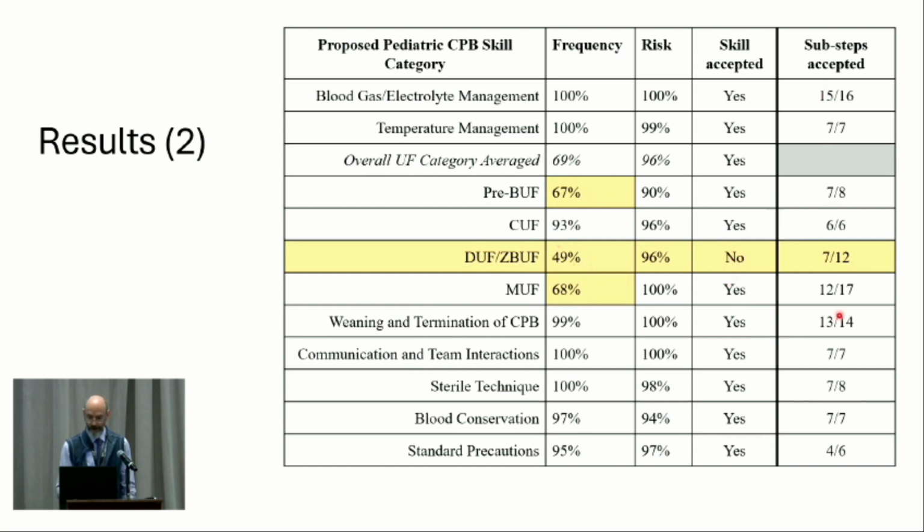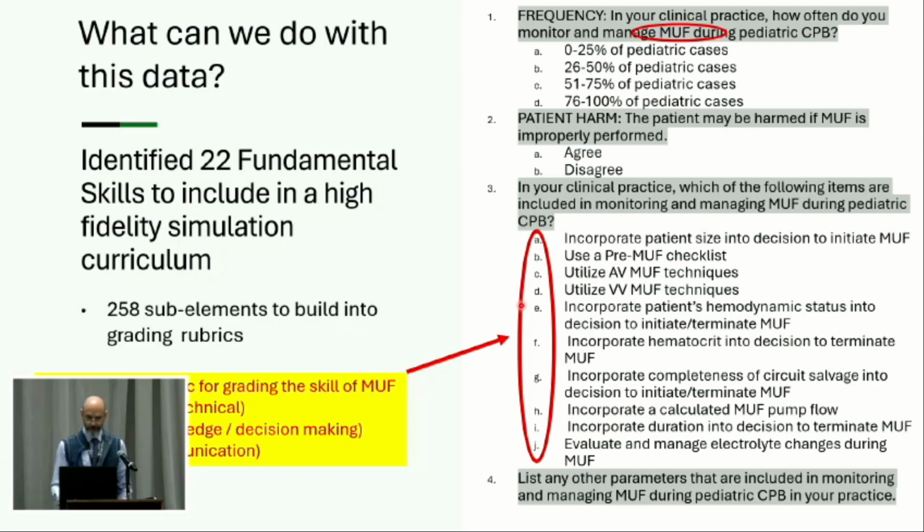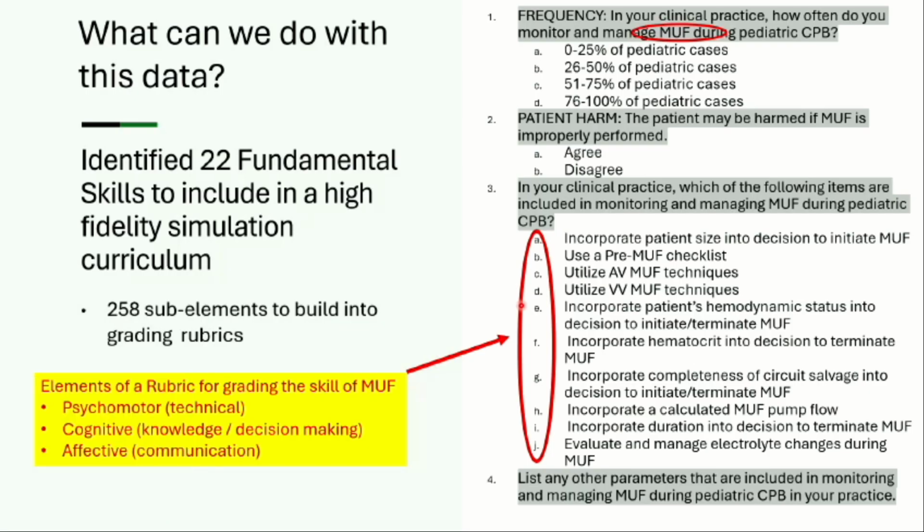But we know a lot about the things that go into these skills. So what can we do with data like this? Well, now I have 22 fundamental skills I can put into a high fidelity simulation curriculum, and we can write a curriculum to introduce them to students in a logical way and test them in the simulated environment.